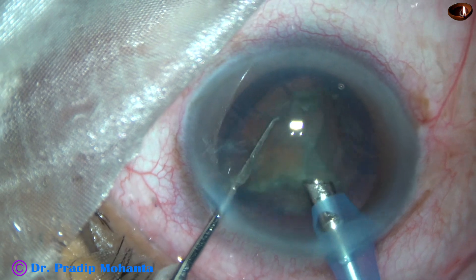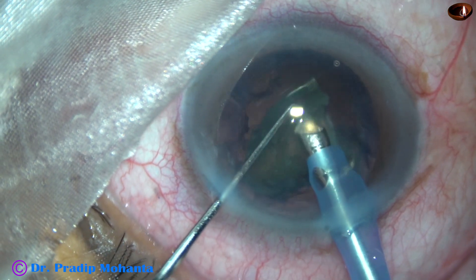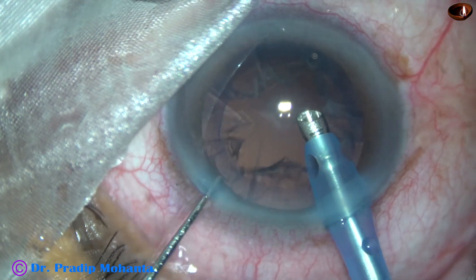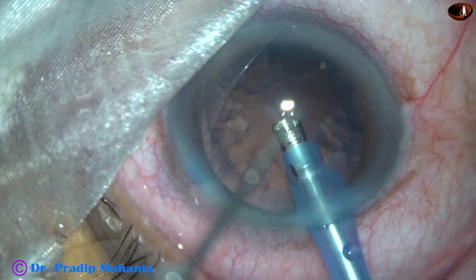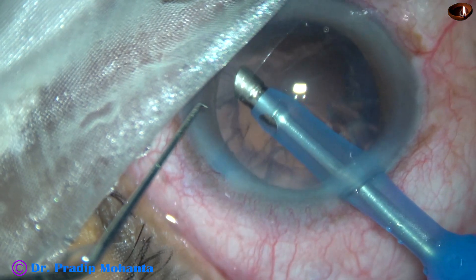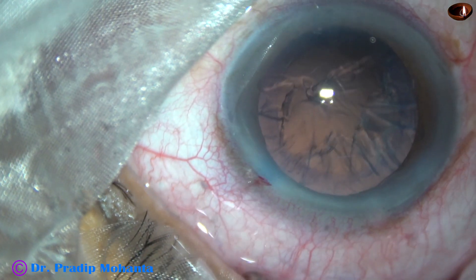During emulsification of the last piece, we can decrease the vacuum to about 300 or 250, and decrease the flow rate to 25 or 30. It is safer to decrease the parameters during emulsification of the last piece. I removed a bit of cortex with the phaco probe itself — the cortex from 6 o'clock. Now in this case, I am going to use coaxial IA from Oatley for removal of the cortex.